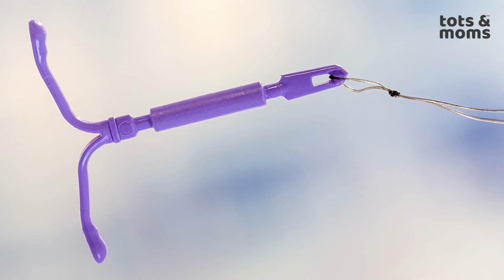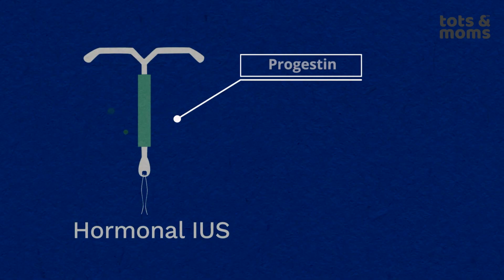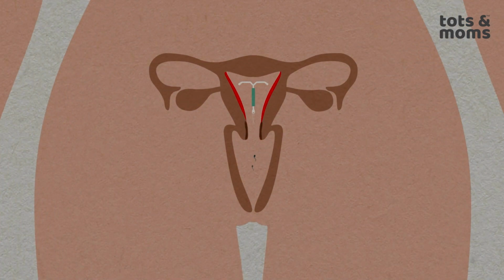The second, and most famous worldwide but not in India yet, though it is highly picking up the pace, is hormonal IUDs. These are again T-shaped, but medicated and hormonal. It releases a hormone called progestin inside the uterus. This thickens the cervical mucus, so a block is created here, the sperm cannot enter the uterus, and there is no chance of fertilization. This is also effective for 5 long years, and a slight drawback is that it is on the expensive side.